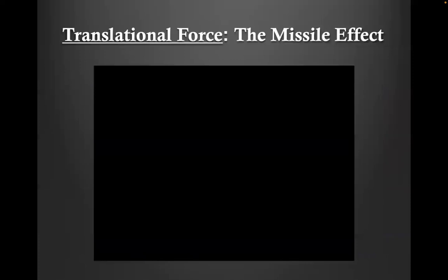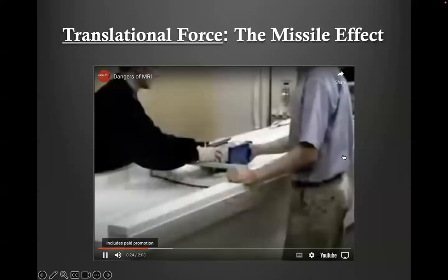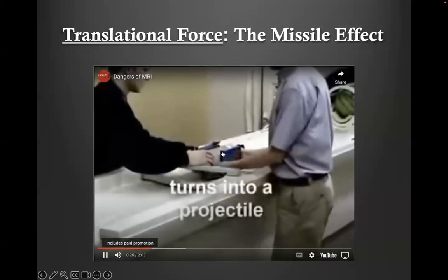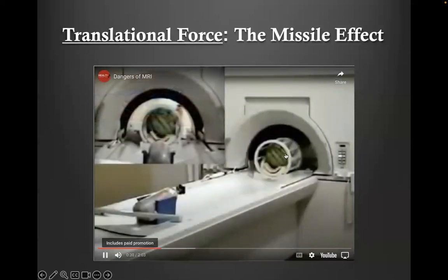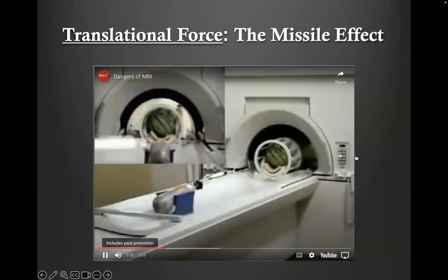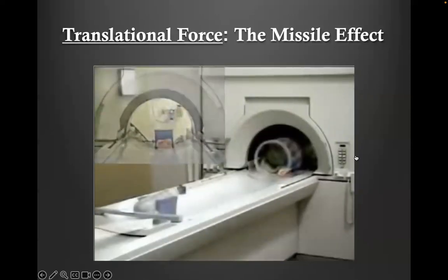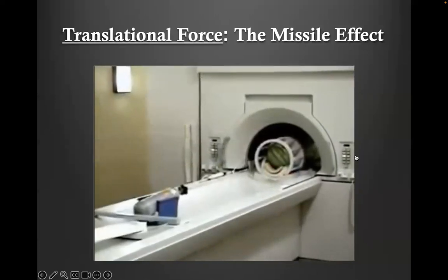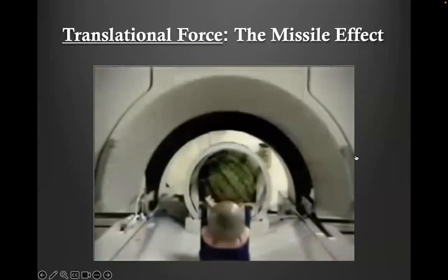For the time of the lecture, I will just end this and you can search for more. But it is very dangerous. I'll show another example here. Just imagine that's a small oxygen tank, and imagine your head is this watermelon there. And that's a very small oxygen tank.